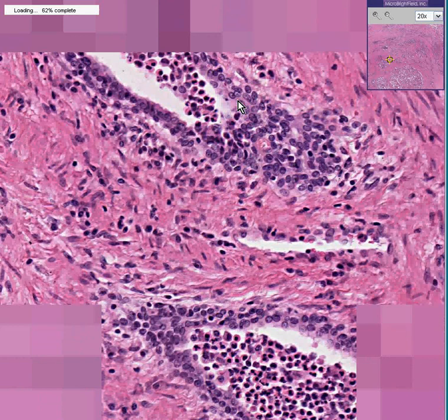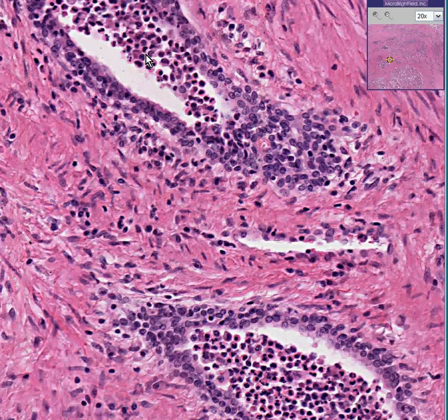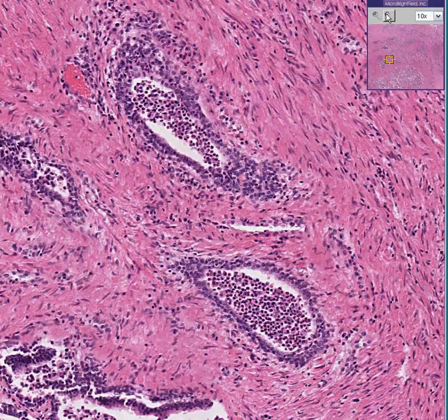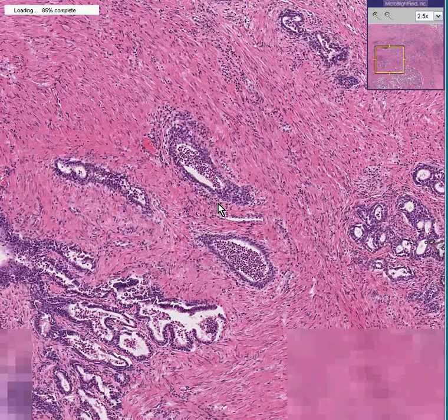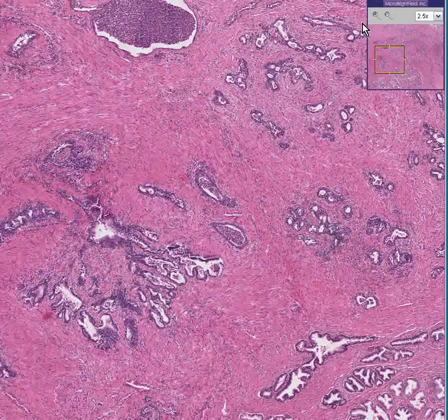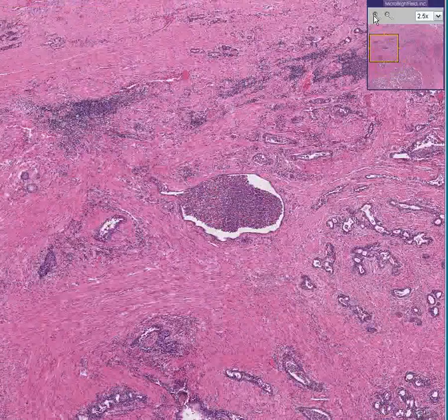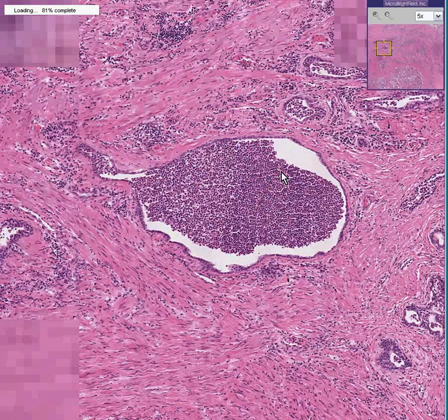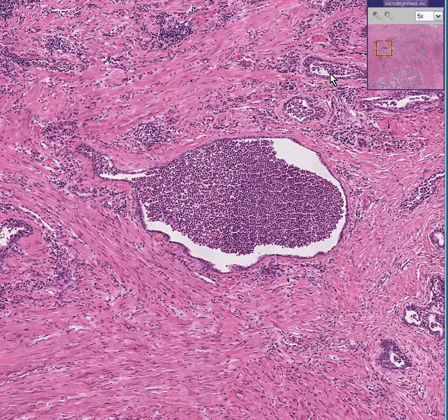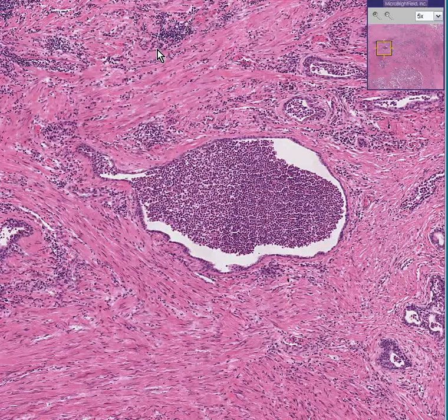Normal prostate glands filled with neutrophils, and perhaps there are even some neutrophils surrounding them as well. In addition, some of these glands are filled so densely with neutrophils that they actually form little abscesses, filling up and dilating the glandular spaces — micro-abscesses. You can also see inflammatory cells in the stroma and not completely within the lumen.